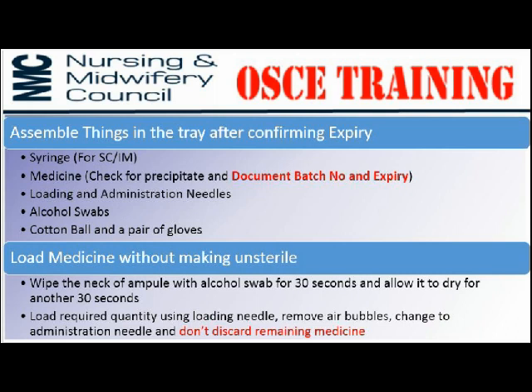Sometimes you will get an insulin syringe if you are administering insulin, so there will not be any use for loading and administration needles. For IM injections, take 21 gauge or 23 gauge needles for administration. For loading, usually take 18 gauge needles. For subcutaneous injections, take 25 gauge needles. Then you need to take the alcohol swabs.